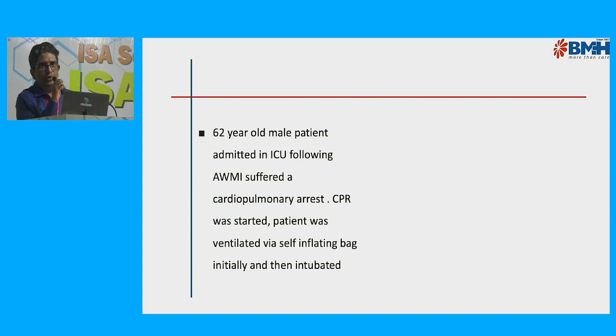Okay. So now we'll go to a scenario. Next person, you can hold the mic. There's a 62-year-old male patient admitted in ICU following anterior wall myocardial infarction, who suffered a cardiopulmonary arrest. CPR was started. The patient was ventilated via self-inflating bag initially, and then the patient was intubated.